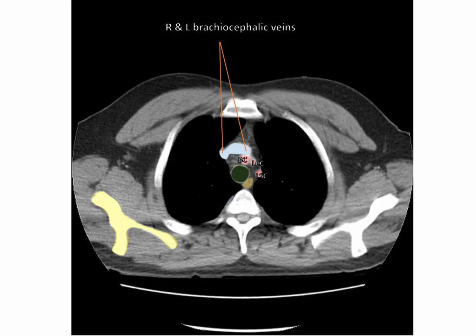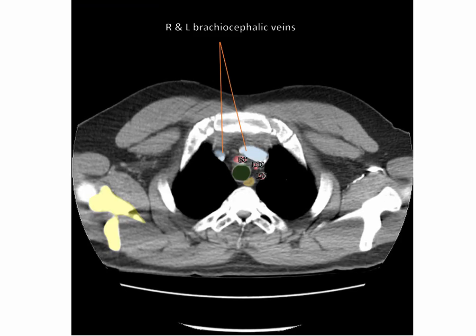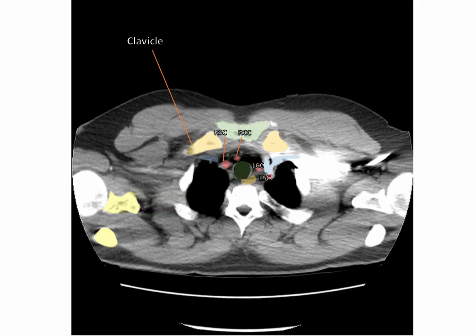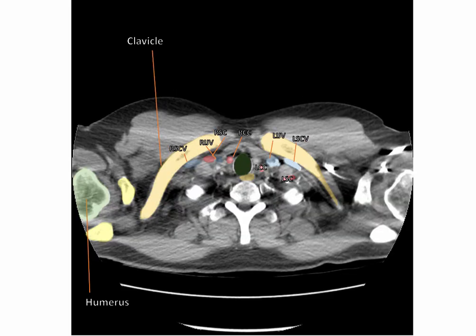When we see the brachiocephalic veins as two distinct profiles, we call this level the five-vessel level. Moving more superiorly, we can see the brachiocephalic trunk branching into the right common carotid and the right subclavian arteries. Also at this level, we can see the clavicle articulating here with the manubrium of the sternum at the sternoclavicular joint. Further superiorly, we see where the humerus is articulating with the glenoid cavity of the scapula at the glenohumeral joint. We see the right brachiocephalic vein being formed by the right internal jugular vein and the right subclavian vein here. Also we can see these vessels on the left. Also visible at this level is the coracoid process of the scapula.